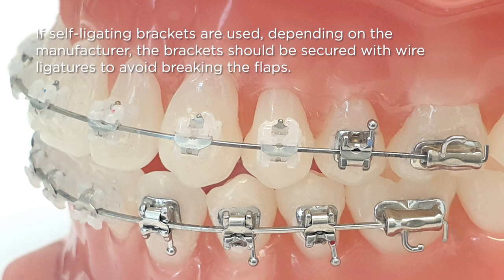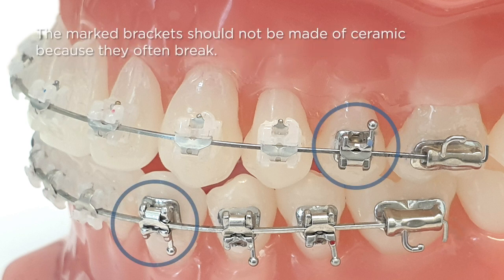If self-ligating brackets are used, depending on the manufacturer, the brackets should be secured with wire ligatures to avoid breaking the flaps. The marked brackets should not be made of ceramic because they often break.